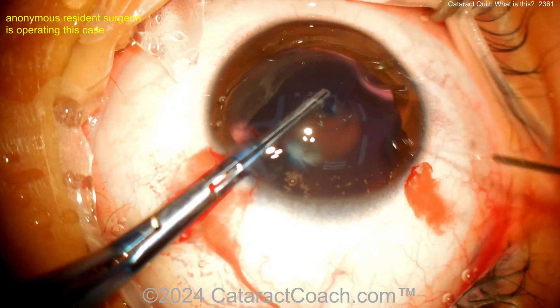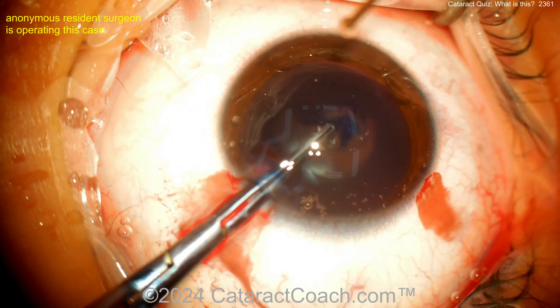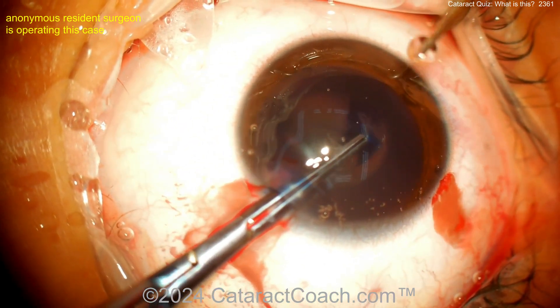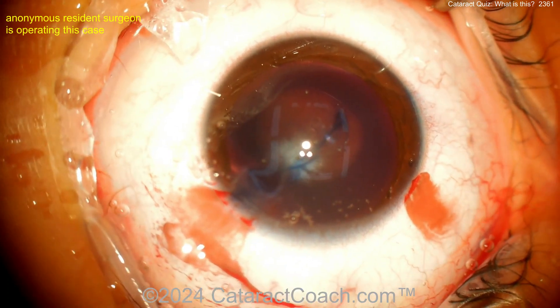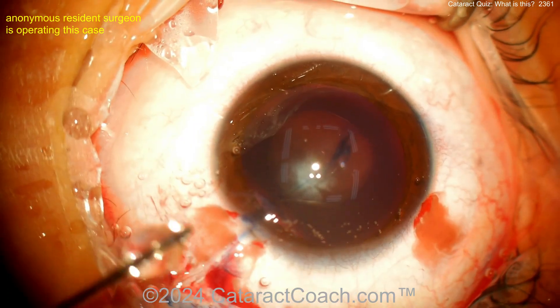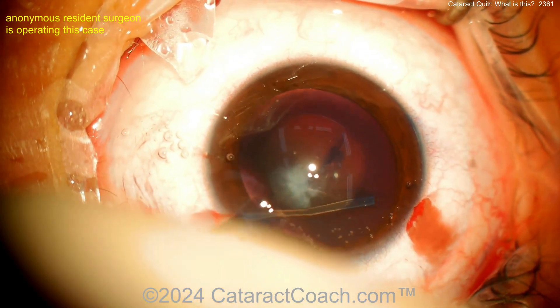Getting the capsulorrhexis done — nice, nice, nice. The lens itself looks very, very soft, so it's very easy to aspirate. You can probably remove the entire lens with just bimanual irrigation-aspiration. The capsulorrhexis looks pretty good. Now releasing some viscoelastic and perhaps some hydrodissection.